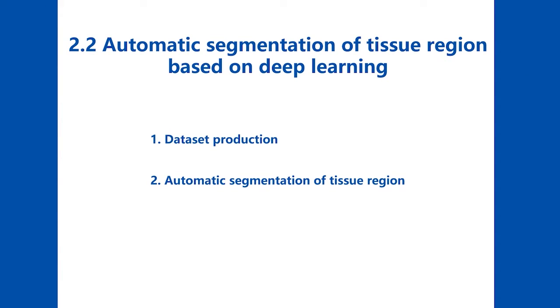Considering that the superpixel classification in the pre-segmentation process involves complex processes such as superpixel division, and the whole pathological image is divided into superpixels for independent classification, ignoring the association between superpixels. For example, superpixels with similar positions are likely to belong to the same organization. Therefore, in order to consider the integrity of the pathological image and obtain some tissue segmentation labels, we can use deep learning technology to directly learn the whole pathological image and complete the automatic tissue segmentation.